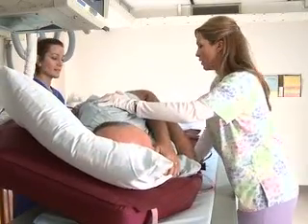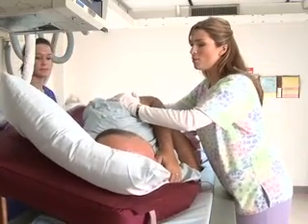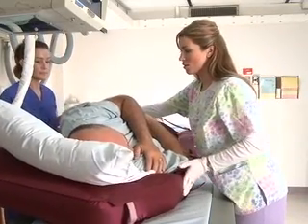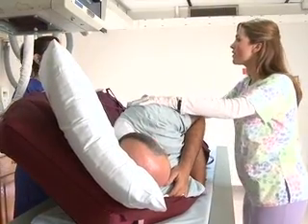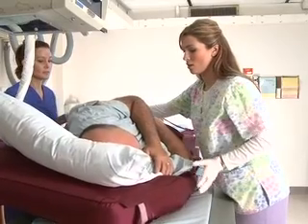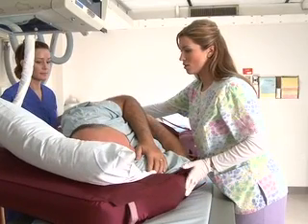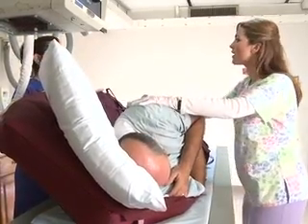As the patient rolls to one side, the caregiver receiving the turned patient will place both hands on the patient's upper and lower body to stop the turning motion and hold the patient. Assess the patient's position. If the body is not yet centered, push the patient's body back onto the inflated HoverMatt and have the opposite caregiver use the handles to pull the inflated HoverMatt back slightly.